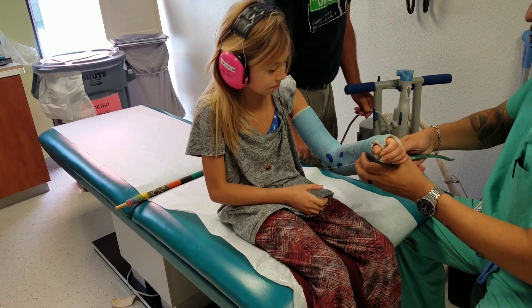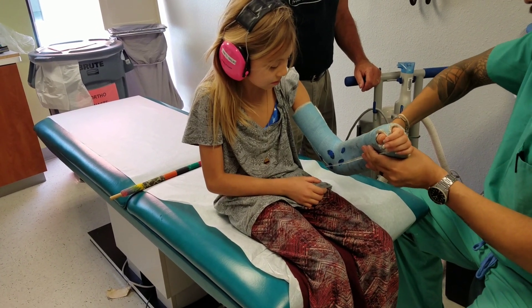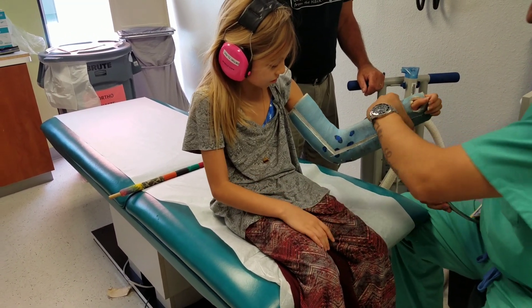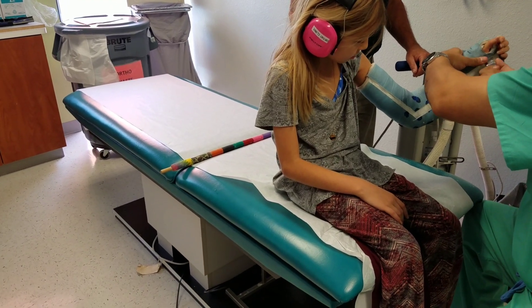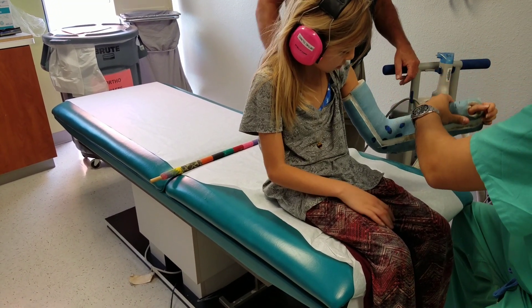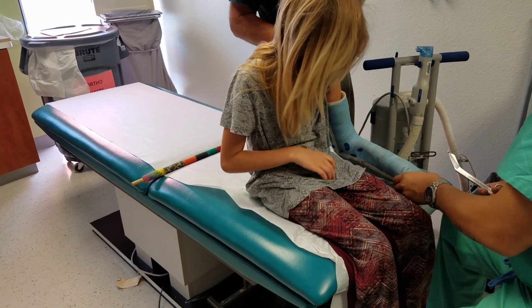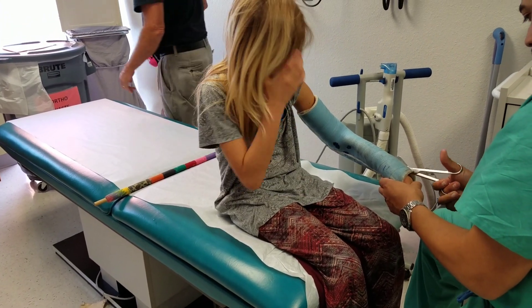It is because she's anticipating a scratch. That little arm's been so squished, it's probably real sensitive. Did you want to keep that one, or are you tossing that one? You're going to have a closet full of cats.